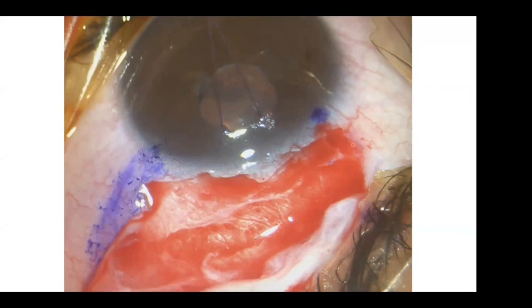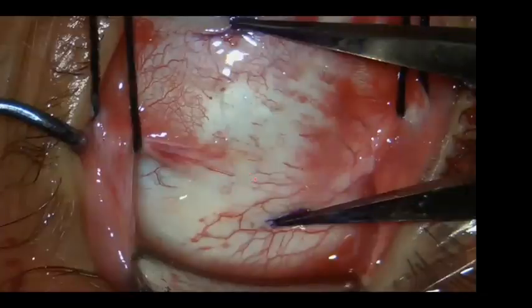So to make it easier for me, while I'm at the 12 o'clock position, I do markings of the lateral rectus and the superior rectus. And then I mark the place of the tube, which is supposed to be here. This is not definite, it is just an expectation. And then I do measurements. I like to have the whole area clear like that.